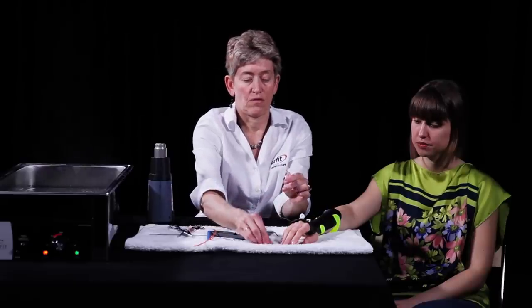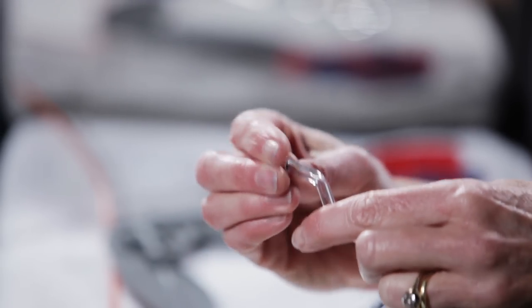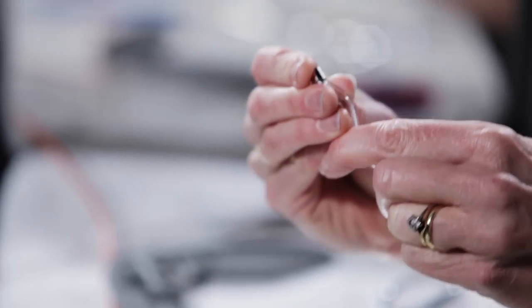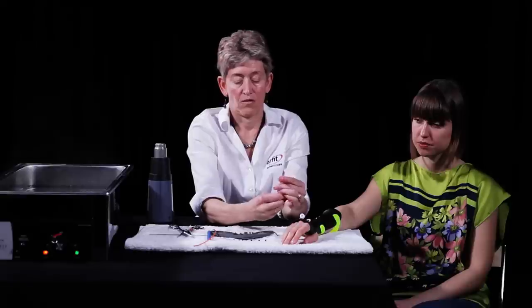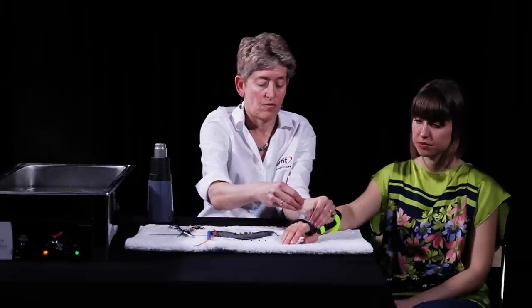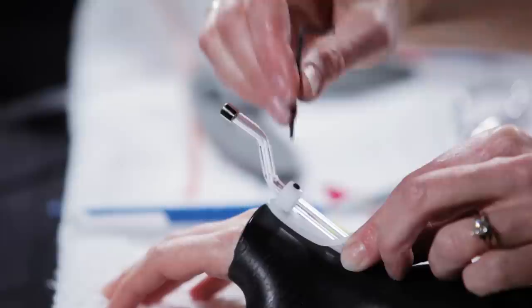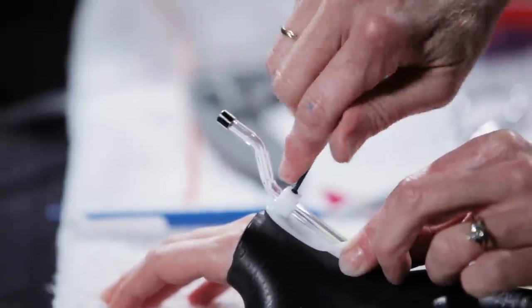Place the OrphiTube end cap on the cut end of the OrphiTube. Place the OrphiTube into the adjuster. Tighten the screw and check the alignment.